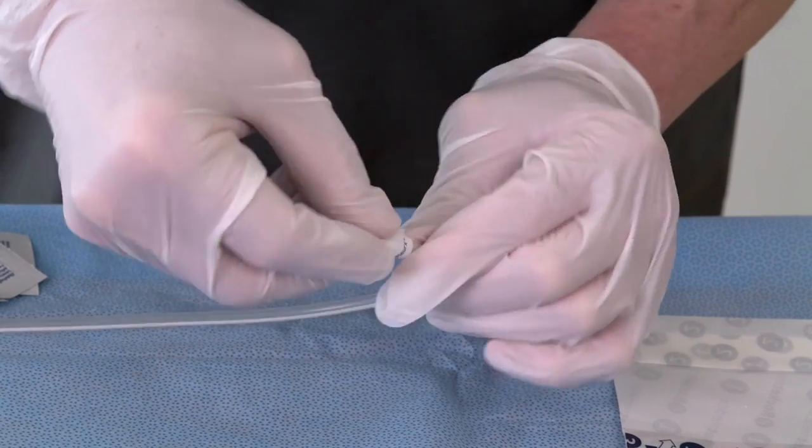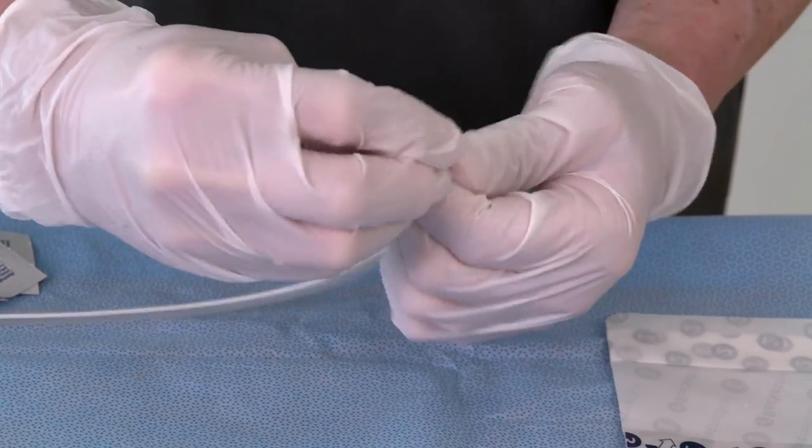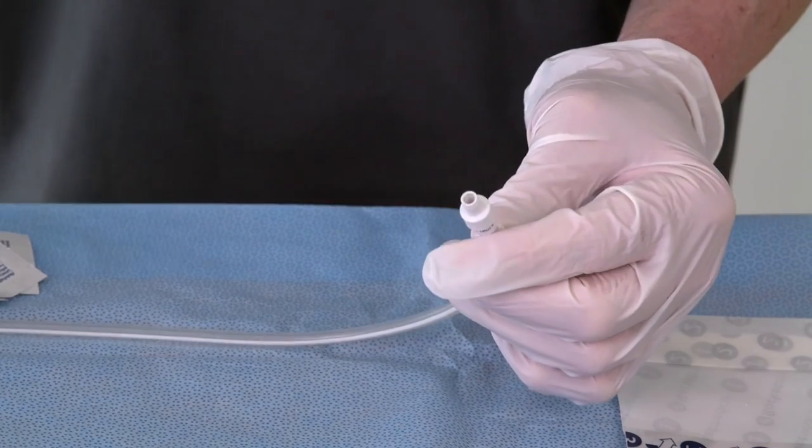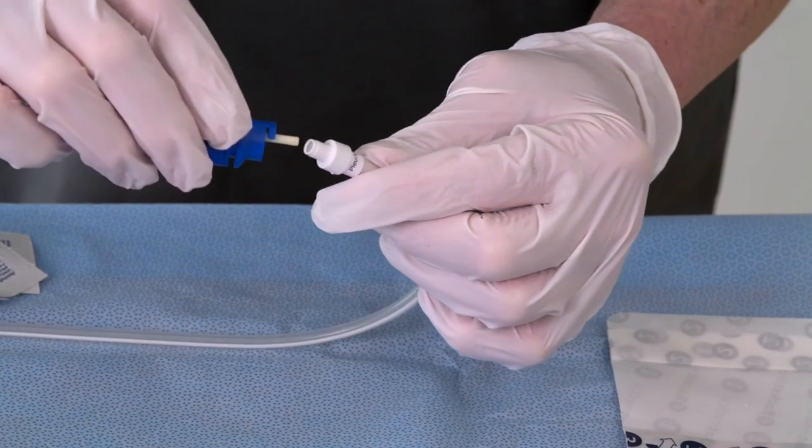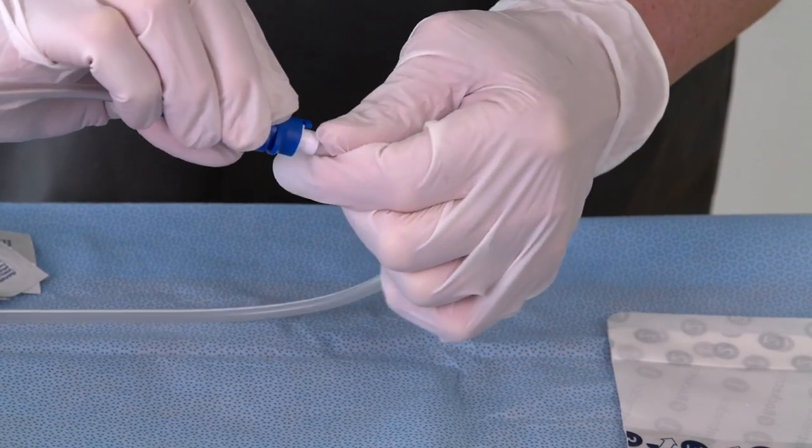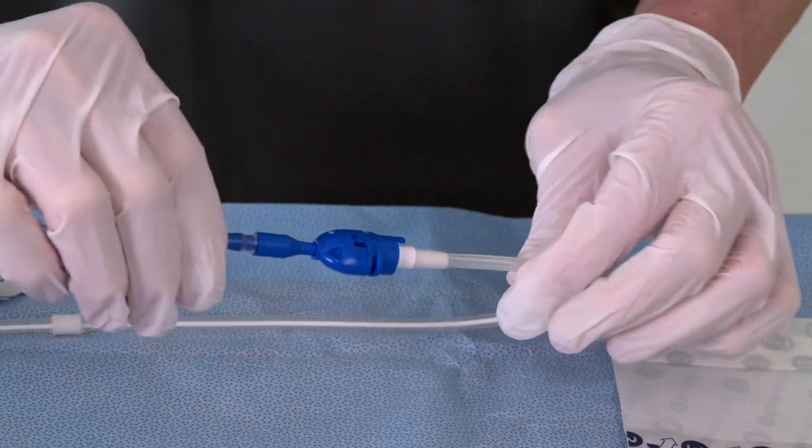Using an alcohol wipe, gently clean around the outside of the catheter valve. Discard the used wipe. Pick up the drainage line of the bottle and gently insert the access tip into the catheter valve. You will feel a slight resistance, which is normal.